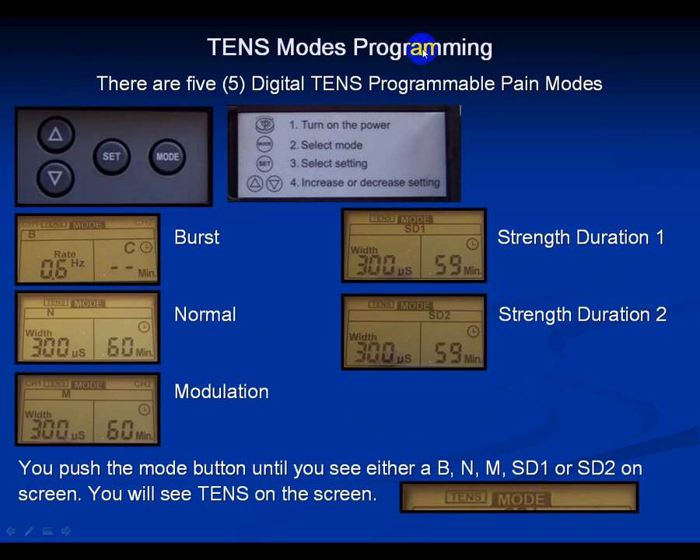TENS has five programmable modes: Burst, Normal, Modulation, Strength Duration 1, and Strength Duration 2. You're going to need to practice each one — Burst, Normal, Modulation, Strength Duration 1, and Strength Duration 2 — on a large muscle group like we're doing right now.